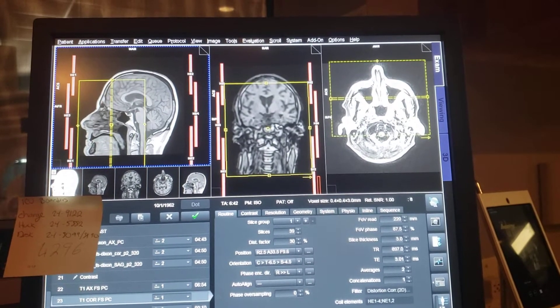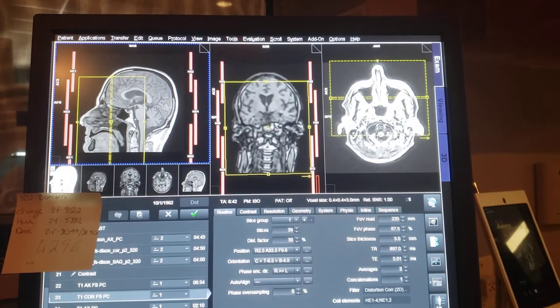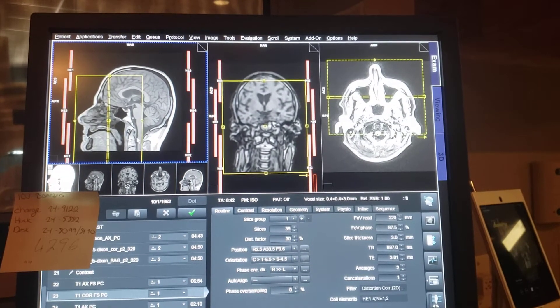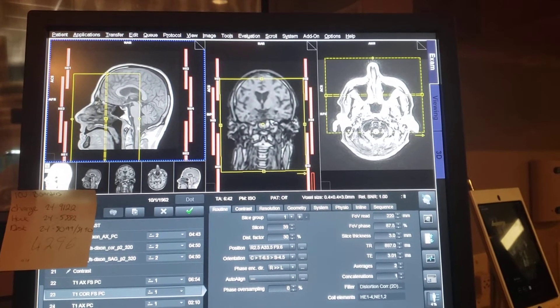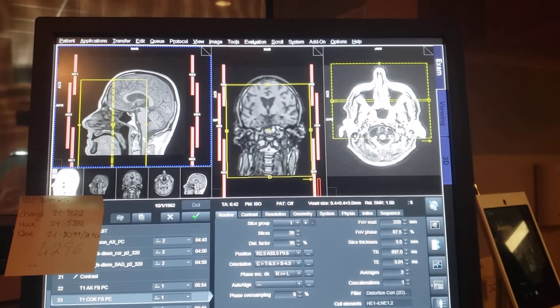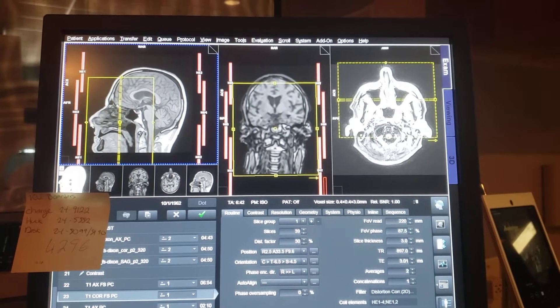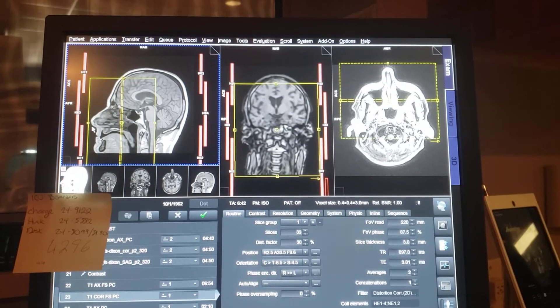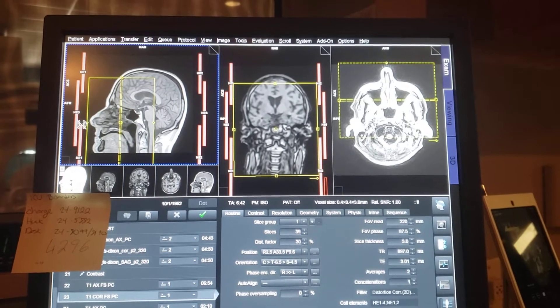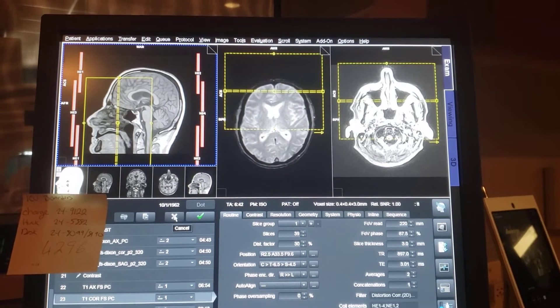For the coronal, you can actually do the front, but make sure you're including the nose — the tip of the nose. Some people go in front of the cord, some go behind it — it doesn't matter as long as you cover the whole face. Make sure you get one slice outside of the nose, so the first line does not touch the nose.